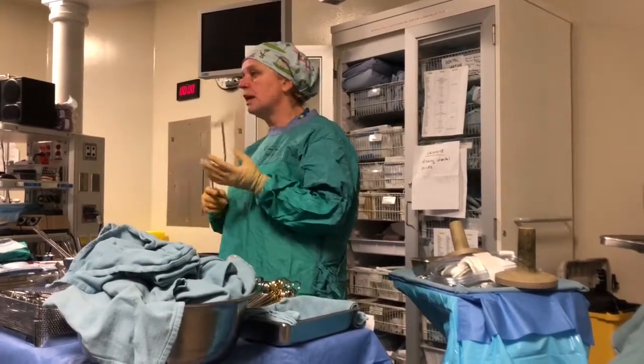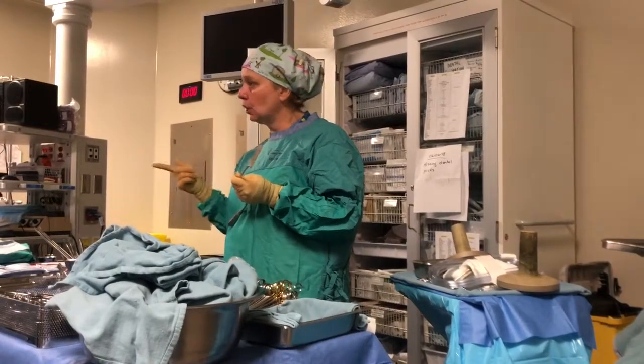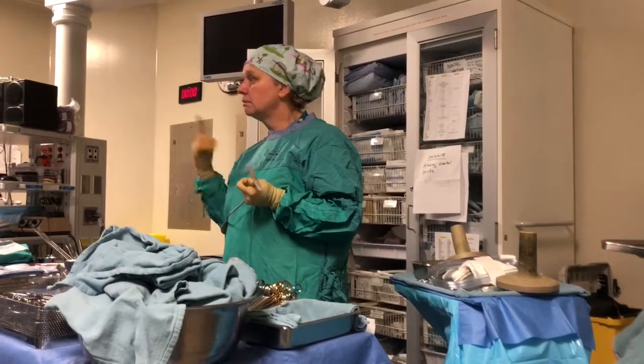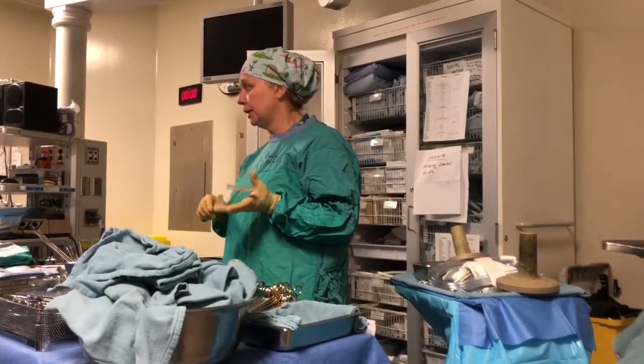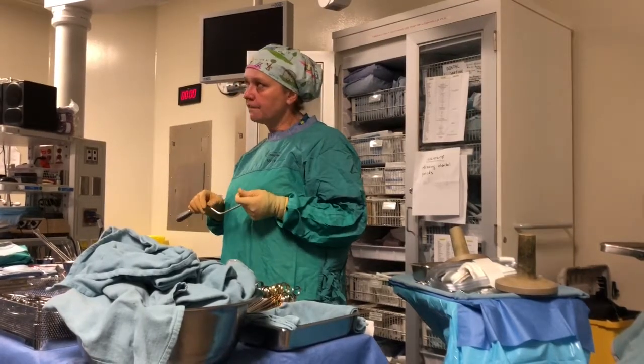In aortas, we have what's called Cell Saver. I mentioned it last week, where we recycle their own blood, which is really cool. So that we can just constantly give them their own blood back, right? Is that new? Something new? No, we've had it for a long time.